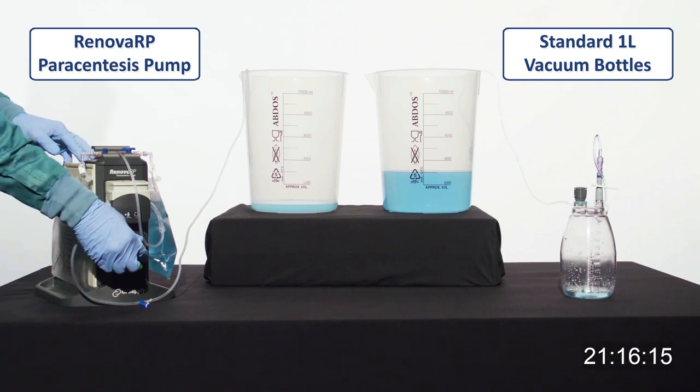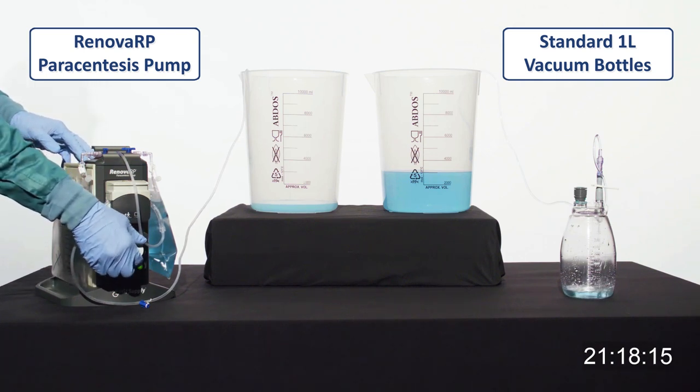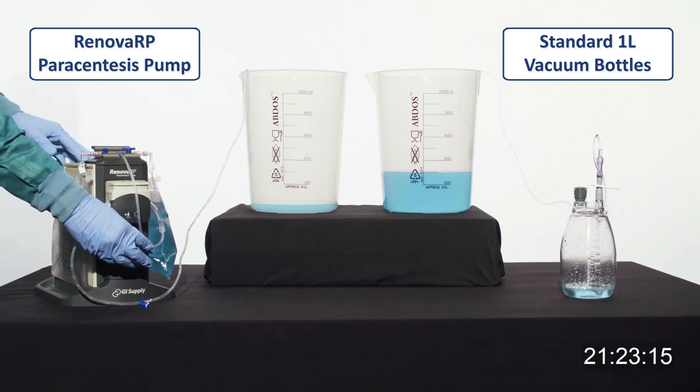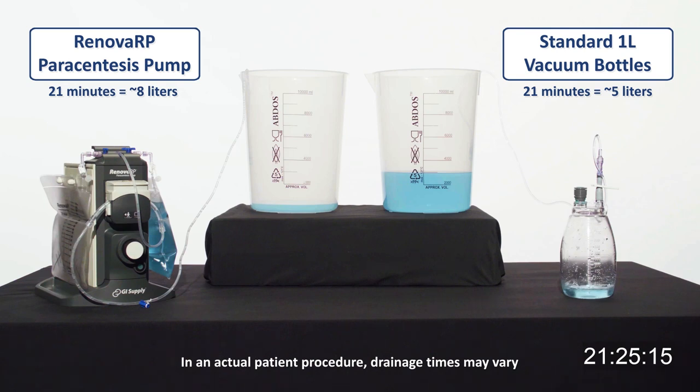In 21 minutes, the Renova RP has drained almost 8 liters, while the bottles have only drained about 5 liters. This demonstration of the Renova RP system shows consistent improvements over the traditional method.